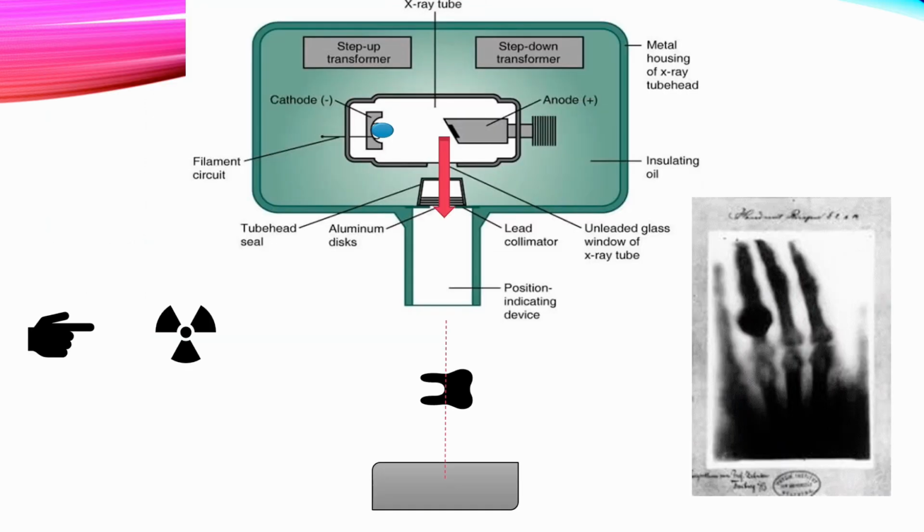Even though the discovery of X-rays dates back to over 120 years ago and has grown in leaps and bounds in technology since then, the science behind it has remained constant. To begin the process of creating this image, you have to first push the exposure button. Nothing will happen unless you push the button. This means that you can turn on the X-ray unit when you get to the dental office in the morning and leave it on all day without worrying about constant exposure. Nothing happens until you push the exposure button.